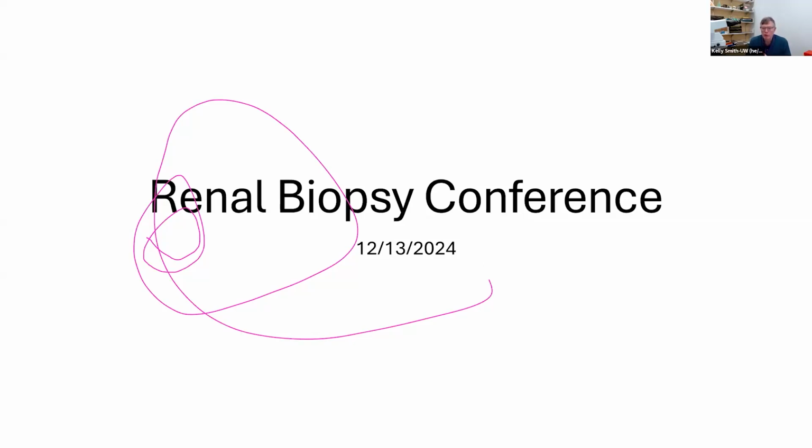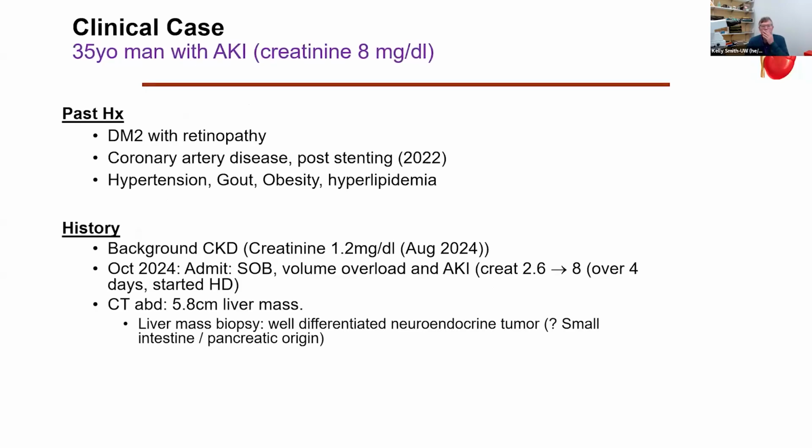We have 3 cases today. So we're trying to fit the full 3 cases in, and I'll get started with the first case. In this, I'll thank Dr. Ashley Jefferson for putting together the clinical history. This was an outside biopsy for a patient who is, I think, very likely to be seen in the near future at the VA. Or sorry, at UWMC.